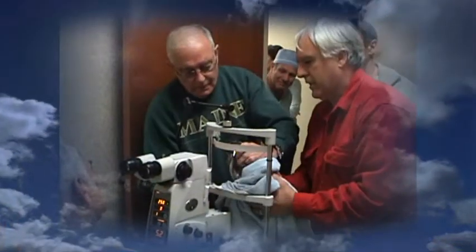And he spread his feathers and he flapped his feathers right here in the waiting room, and he was sort of crying. He was a little bit frightened, I think, for where he was. We had a big crowd here watching to see what we were going to do that day. The hawk got quieted down after a while, and the owner wrapped the hawk up in a blanket and held the hawk very tightly and brought the hawk to the laser. And holding the hawk, he also held his head very still so we could focus the laser on the eye.